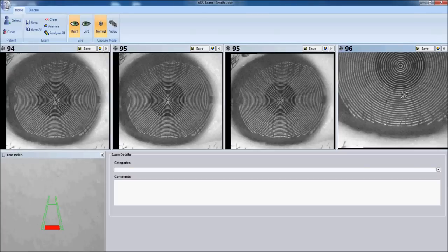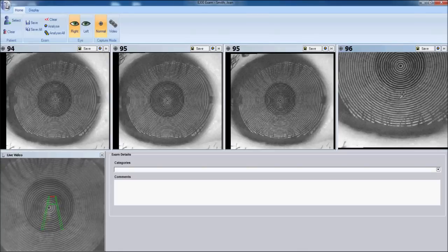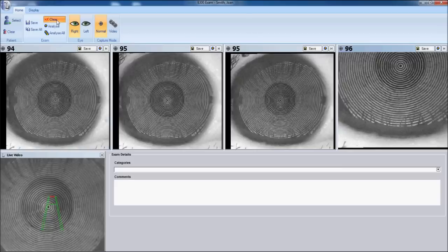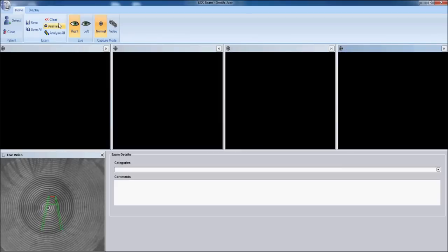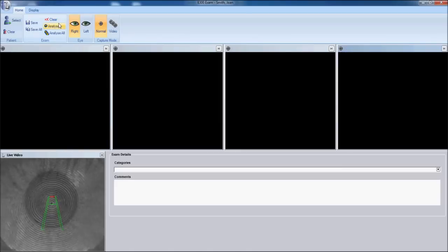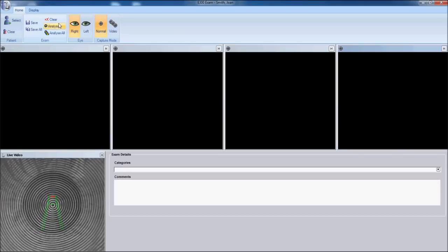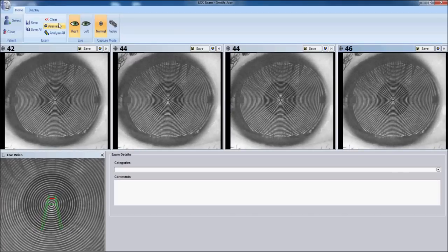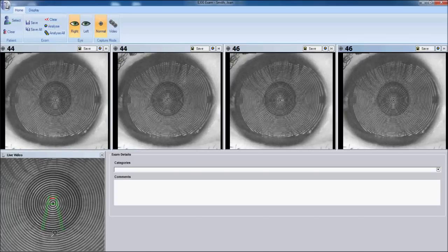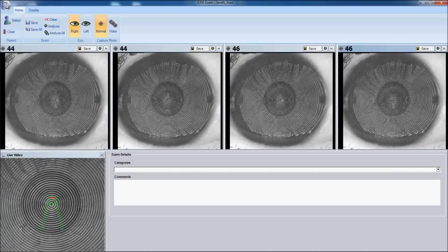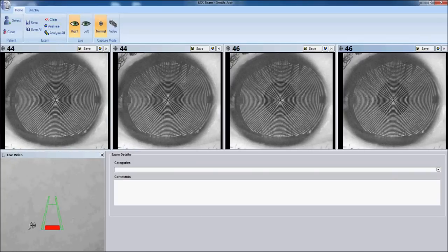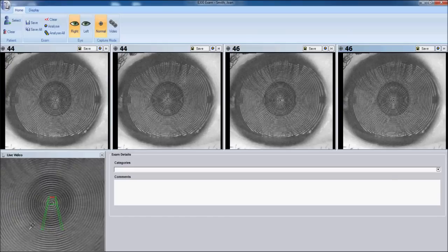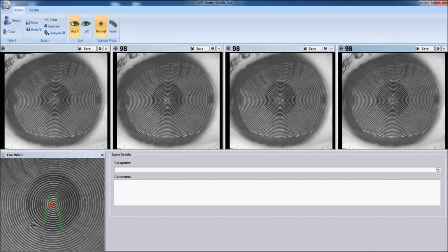Ask your patient to blink just prior to capture. And then move in when you see the placido reflecting parallel and even. Let's again focus in on that video image. We'll put the instrument near into position with the green crosshair. You can see there's a little bit of tear film breakups at various points. We'll ask our patient to blink to smooth that out. When it's smooth, you can go in and take your capture.